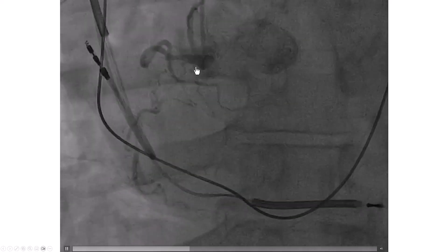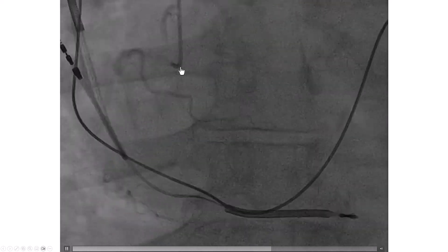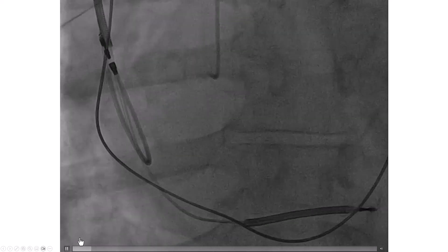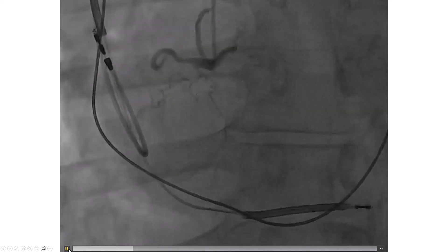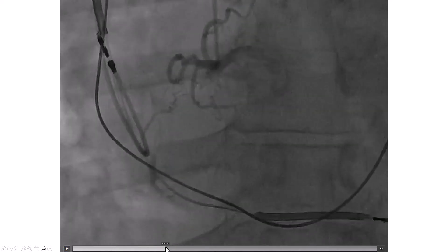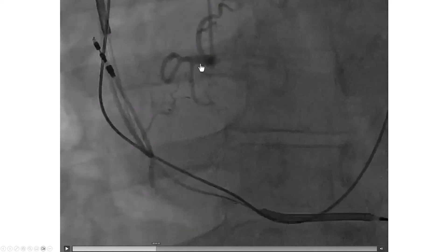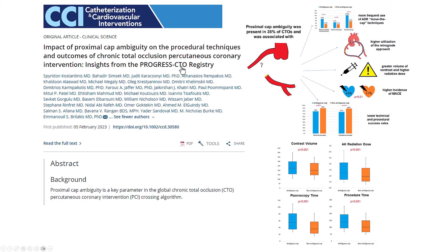Proximal cap ambiguity is the inability to determine where the origin of the CTO is. This can be a very important parameter because we do not want to advance guide wires in the wrong location, as this can lead to perforation. For example, the occlusion could be arising at this point or at this point, and it's hard to know exactly where it is.